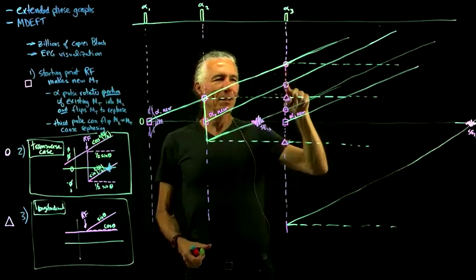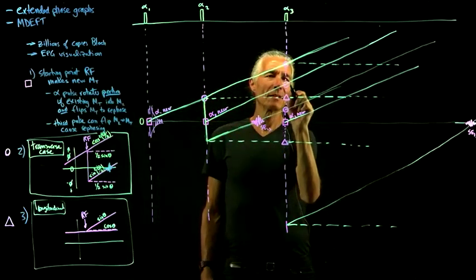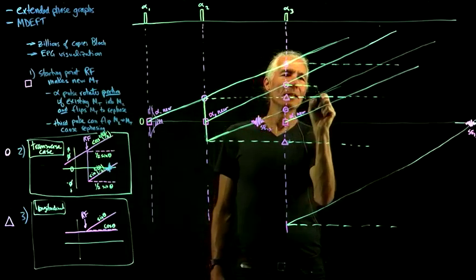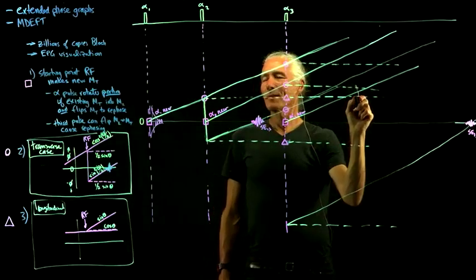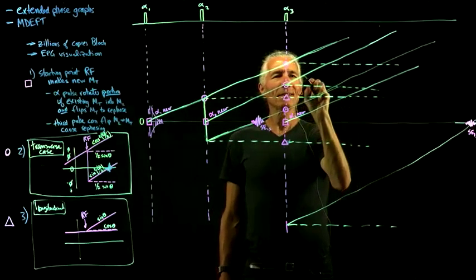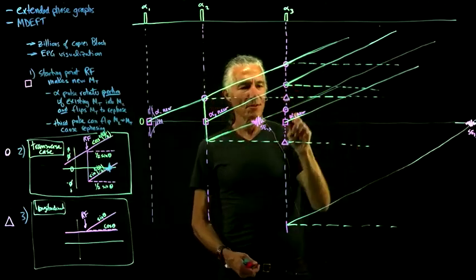Okay, now we got to apply rule number 2 to this guy, and so the same thing happens here. So we've got to save some transverse and longitudinal there, add on to this guy, and then go, where's 0? 0 is here.